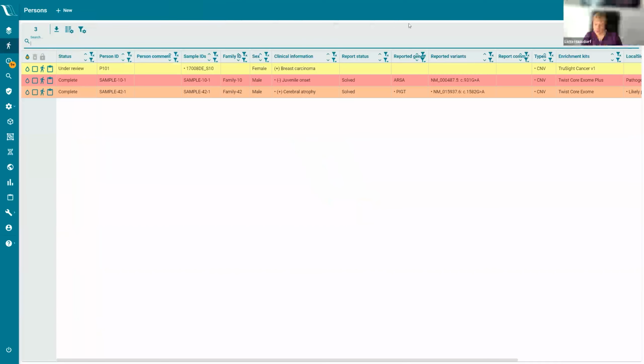There's actually a follow-up regarding the comment. I think it's asked if you can comment on the criteria in general. We don't offer that you can comment on any ACMG criteria, but we have a lot of comment functions. So you can comment on variants, you can comment on the gene, on a gene region, basically.